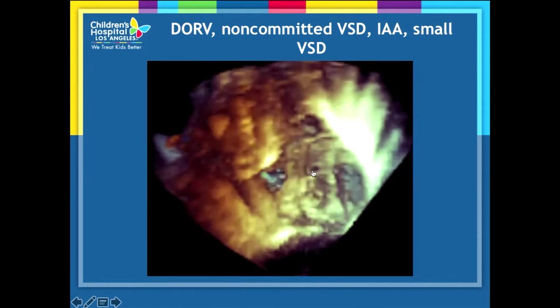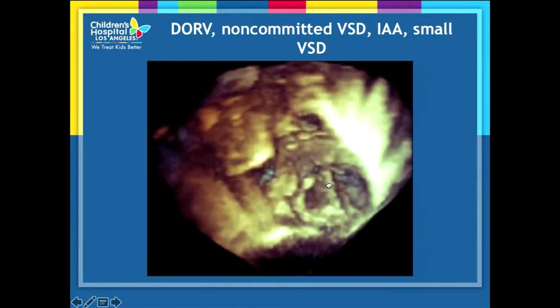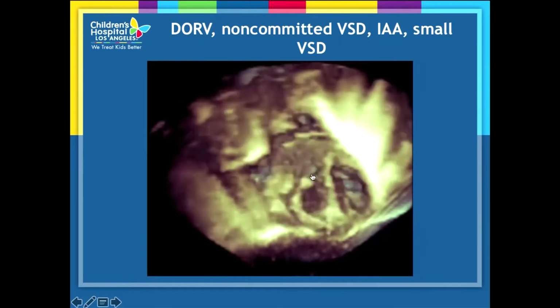When it contracts, it's probably about 50% of the area of when it is in diastole. You wouldn't get that with a static 3D printed model. And this was really important because when the surgeon evaluated this and did the repair, they actually had to resect a lot of muscle there, because it really looked like it was contracting quite a bit. The other thing that's nice about this is that we can rotate this around and crop it a number of ways.